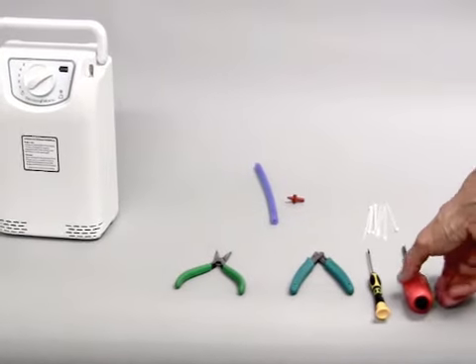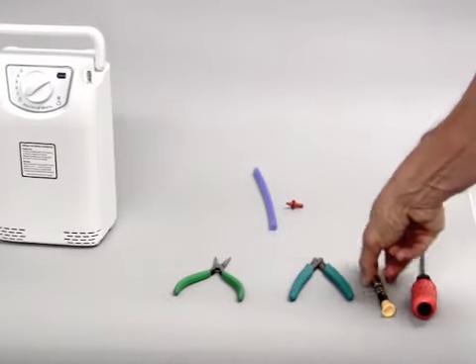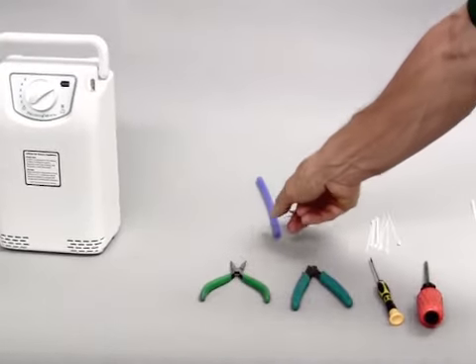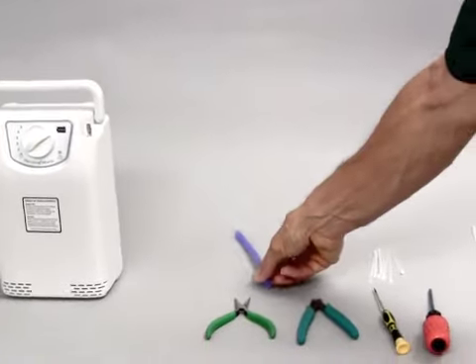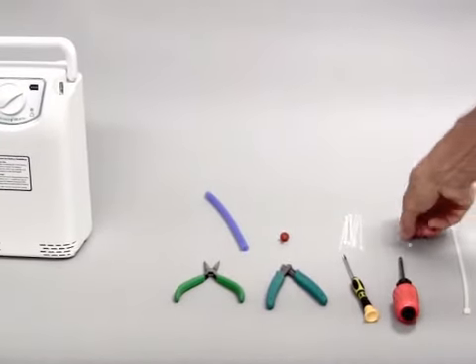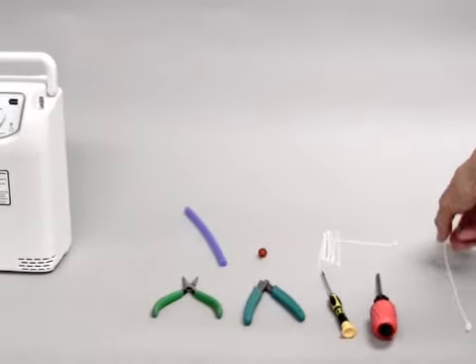These are the tools you'll be using to disassemble the POC. You'll need a Phillips head screwdriver, straight blade screwdriver, small pair of wire cutters, small pair of needle nose pliers. When we get to the sieve bed, you'll have to use a piece of tubing to protect the sieve and a plug. Also required will be small wire ties, approximately 3 inches in length, and you'll also need 2 wire ties when we replace the battery.